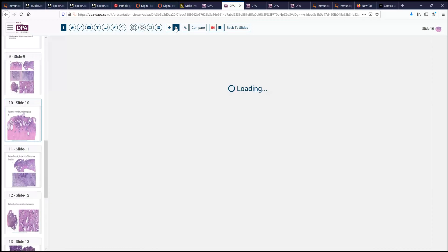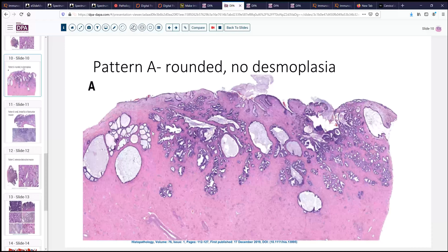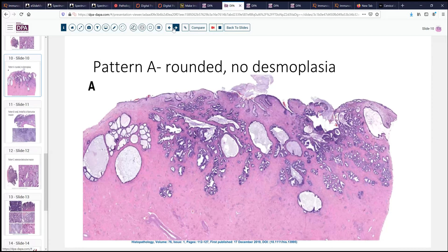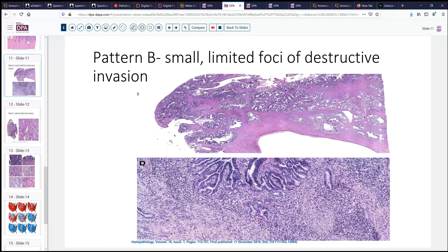Pattern A has rounded nests without any evident desmoplasia. You see it going fairly deep, much deeper than our normal endocervical glands, and there's no response in the stroma. Pattern B, in contrast, has small, very limited foci. It can be rounded large areas and diffusely invasive, but the amount of stromal response, the inflammatory response, and any identification of single cell or small glandular drifting off away from the invasive glands is cause for classifying as pattern B.